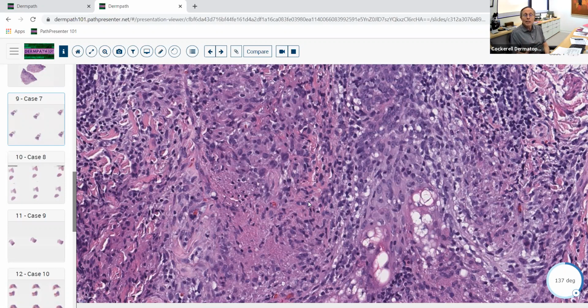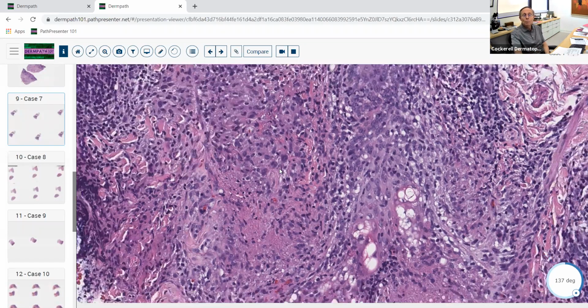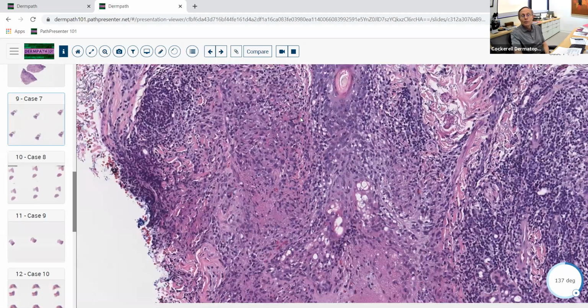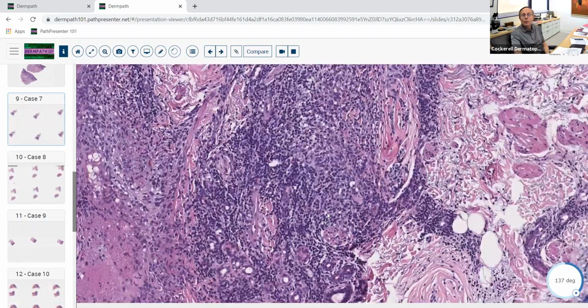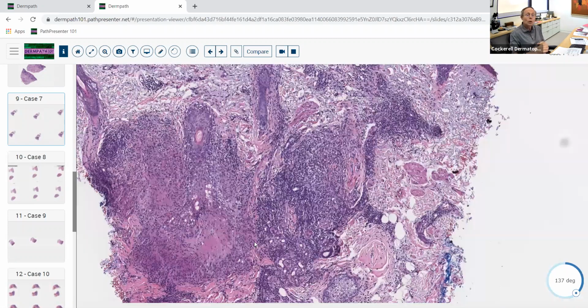Now, one other thing about rosacea, sometimes you can see sarcoidal granulomatous dermatitis there. It can simulate sarcoid. So just remember that from a clinical perspective. But here, it's got this beautiful example where we've got the tuberculoid granulomas. One other thing about rosacea is sometimes if you biopsy, you may not see any granulomatous inflammation or suppuration of the follicle. You can get a lymphocytic perifolliculitis and a lymphocytic infiltrate that can be photoexacerbated.